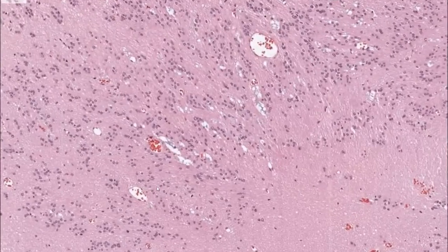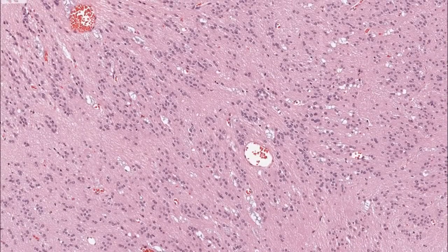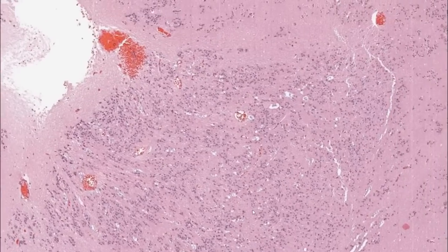Smears, they don't smear well. That's something to have in mind. You have a very glial background, and the smears usually smear in clusters, so the smears don't help you very much. The frozen sections are very telling, and you can make this diagnosis in frozen section.